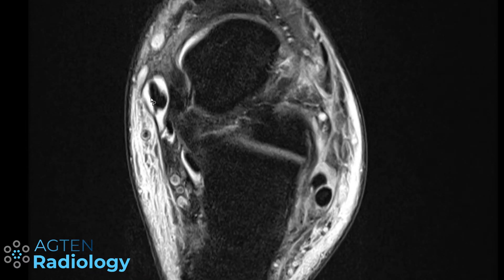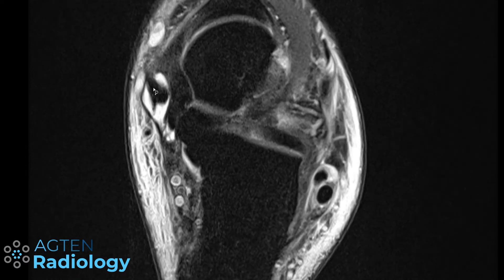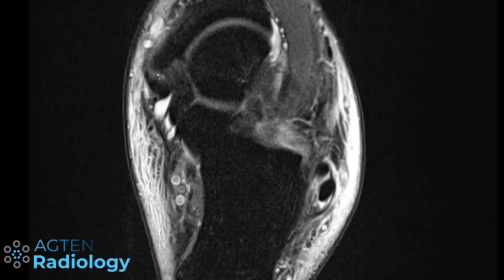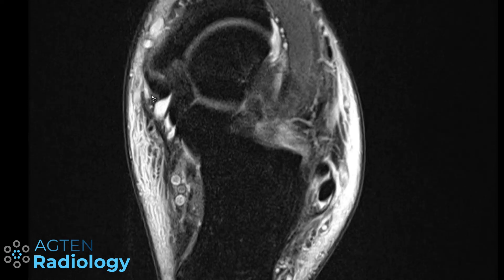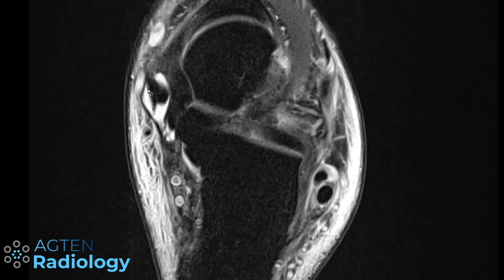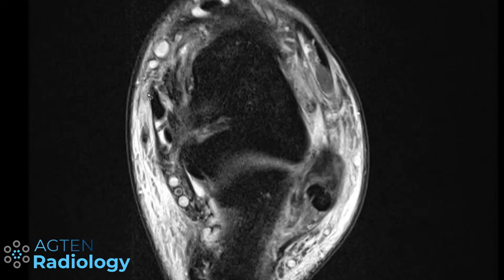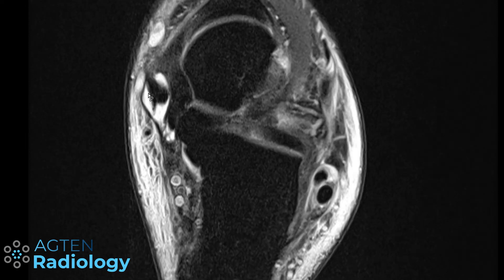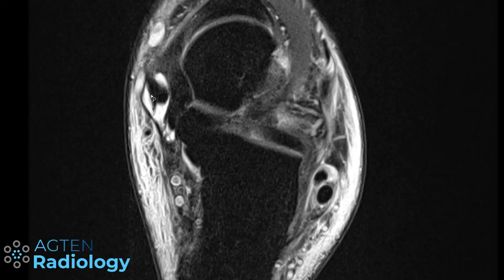So basically what I did so far: I flagged fluid around the most distal portion, and you can see we are very close to the insertion — certainly within the last 2 cm of the posterior tibial tendon. Previously I just called this peritendinitis of the posterior tibial tendon.